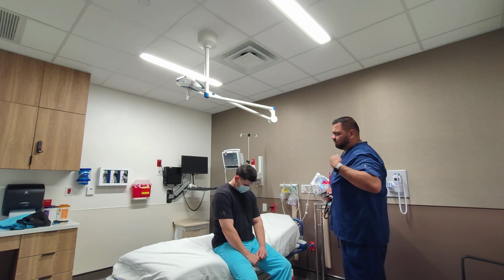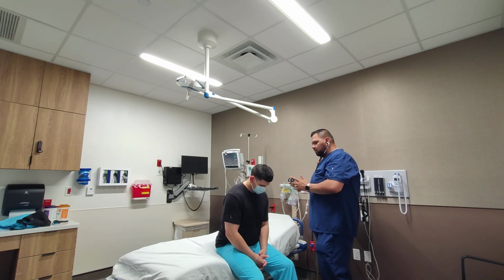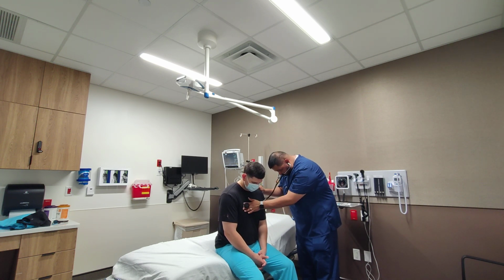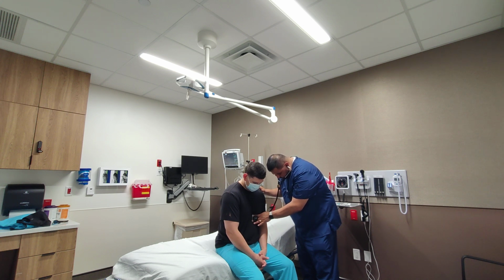left fifth intercostal, the midclavicular line. I'm gonna go ahead and take a listen. Got the aortic, got the pulmonic, Erb's, tricuspid, mitral.